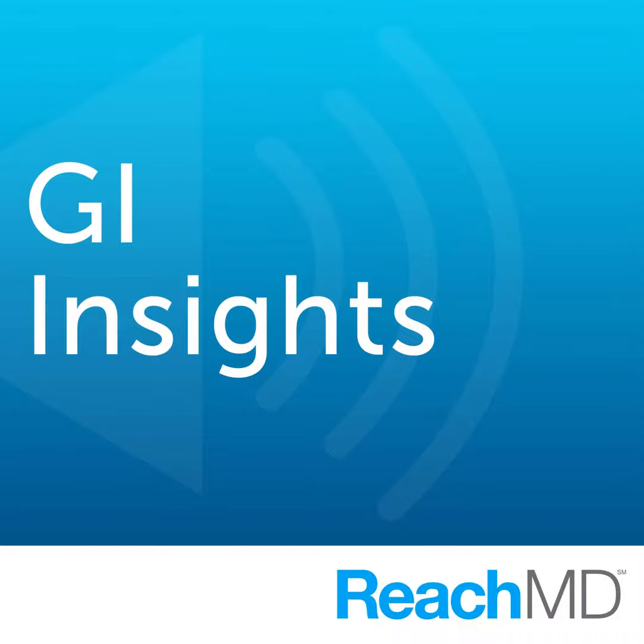The presence of fistula and abscess is very important, because if I do see a fistula right with a stricture, I tend not to dilate those strictures. In fact, the presence of a fistula, we also mentioned in the guidelines, should almost be taken as a contraindication for balloon dilation, because theoretically, you may then increase the size of the fistula from a small opening to a bigger opening.